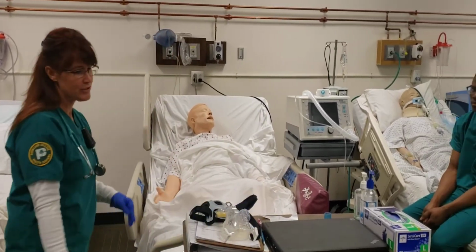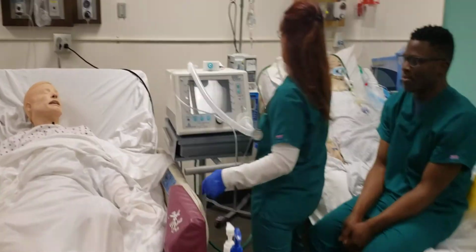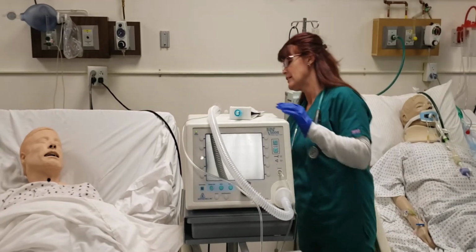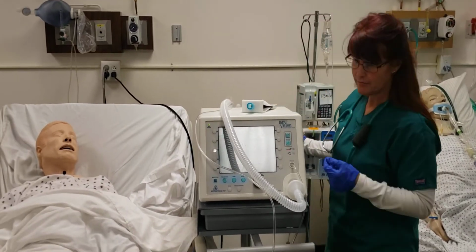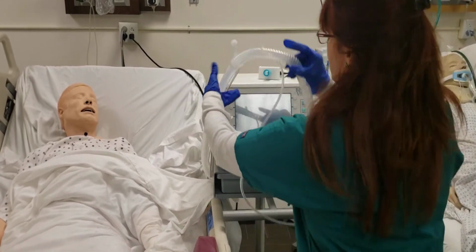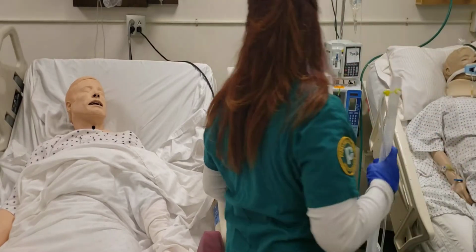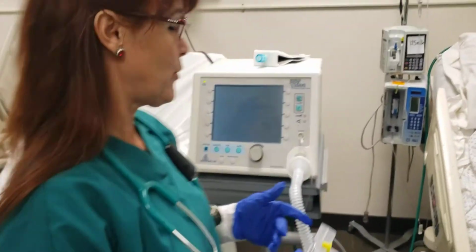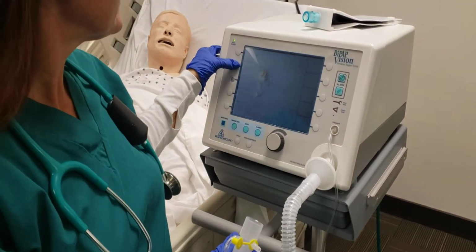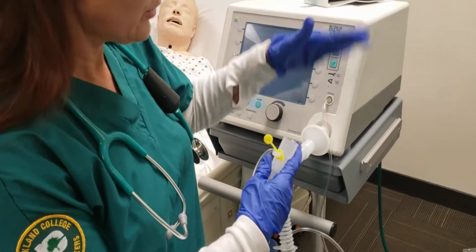Now I'm going to go on over to the ventilator. So you would make sure you got your oxygen hooked up and make sure it's plugged in. Turn it on from behind the machine. All right. The first thing we're going to do is the test port leak. So start it here. And then you're going to occlude the top of this, leaving the port open.